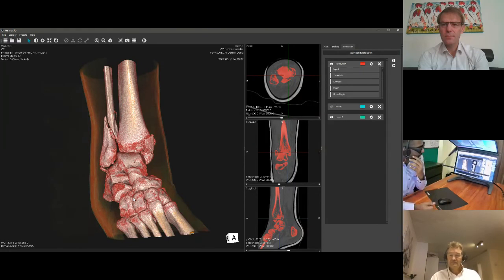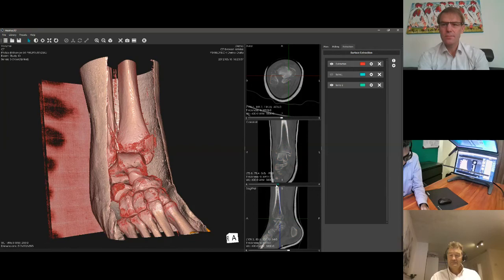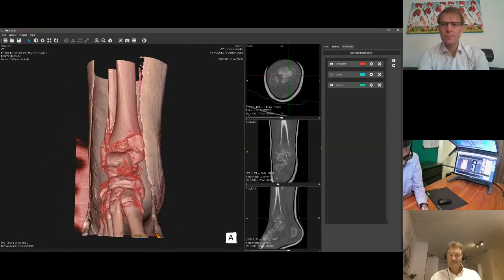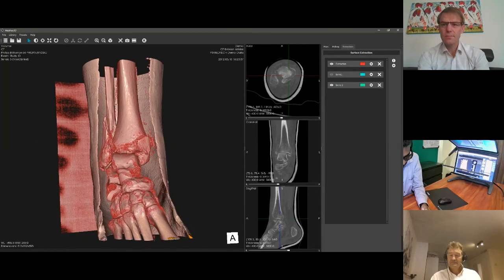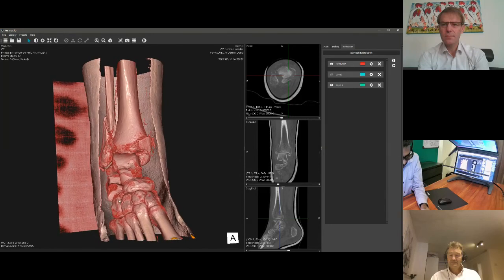I wanted to show you also that if there are very complex fractures, in this case in an ankle, the benefit of not having to go through your normal scans to understand where all the fractures are and how they're all correlated, by getting the information into a true 3D model, and this is not the model because it's the real data, is that understanding what's wrong is so much easier, so immediate to anyone.